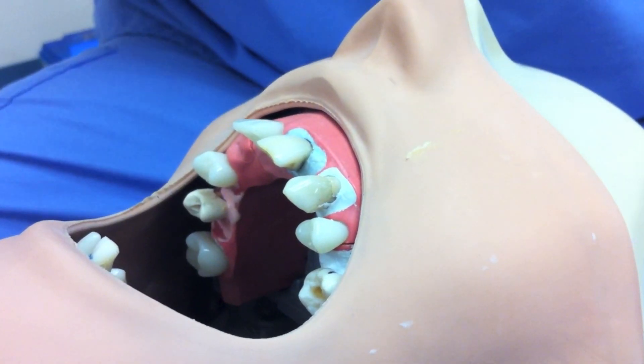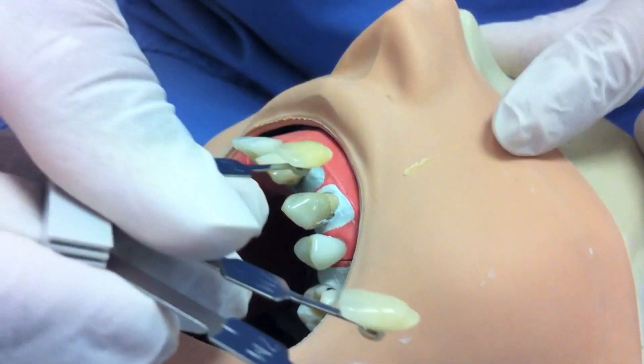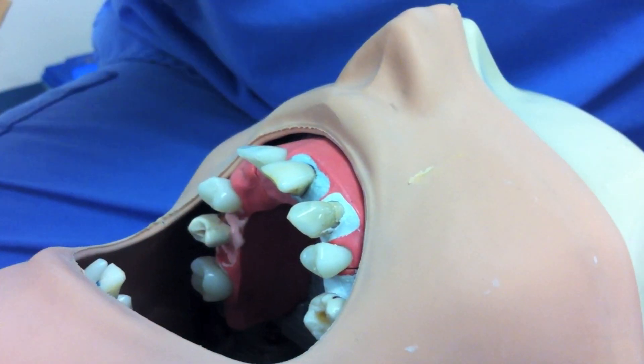Tooth color is evaluated with a shade guide and clinical photographs are taken at the beginning of and throughout the procedure. These provide a point of reference for future comparison by both dentist and patient.